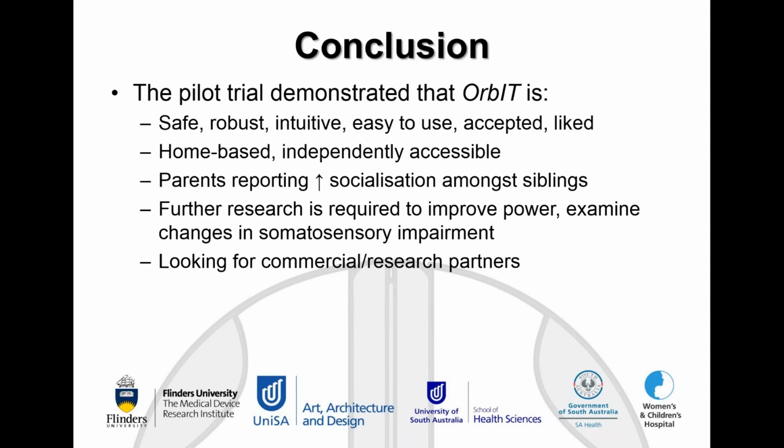So in conclusion, the randomized controlled trial, the pilot trial from our PhD for what we call the Orbit gaming system, because Orbit combines the Orbi controller and an aspect of IT, which is the laptop. We deployed it safely to 18 families here with very minimal support. I dropped it off, gave an overview for about 15 or 20 minutes and left it with families for 6 weeks and then collected it afterwards.